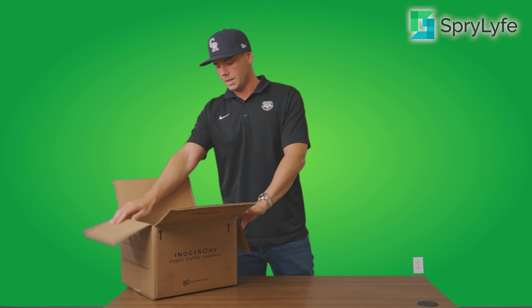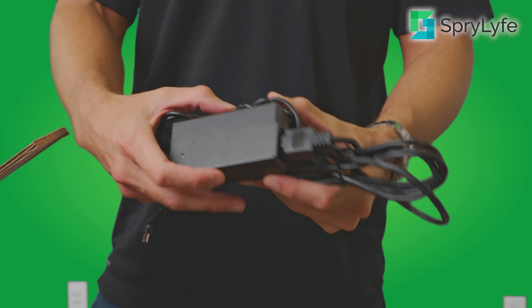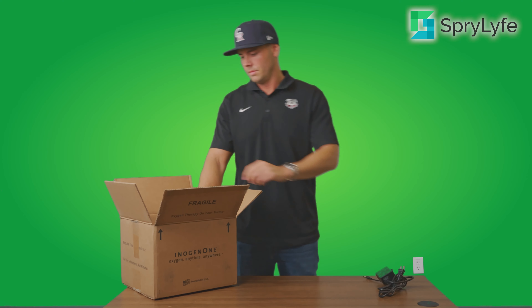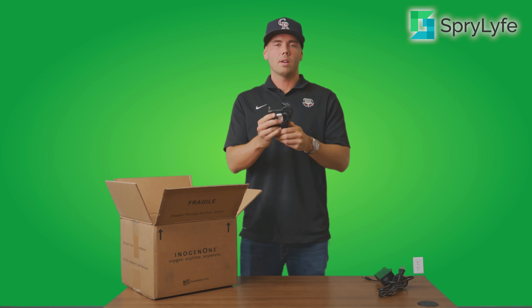Starting off, you'll open up the box and right away you will have your AC wall charger for the Inogen 1 G4, which you can see here. You will also get your DC charger for the Inogen 1 G4, which allows you to charge it while you're in the car on the go.